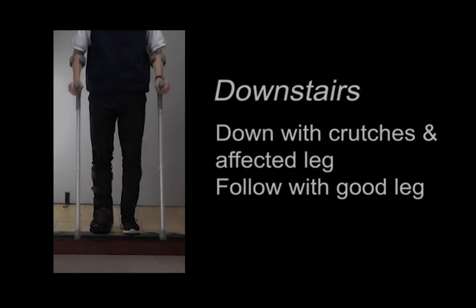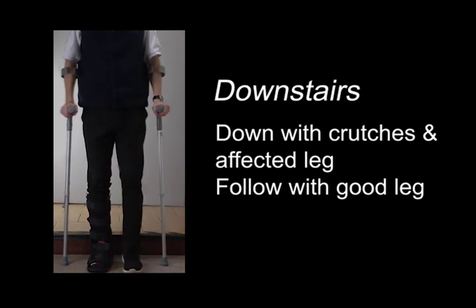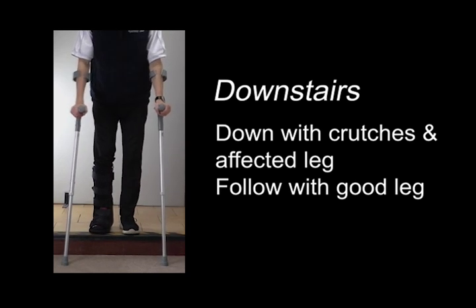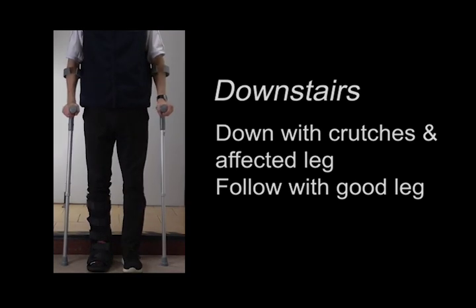When you go down stairs, you put your bad leg — that is your affected leg — down with your crutches, before following with your unaffected leg. So your good leg always helps with lifting and lowering your body.